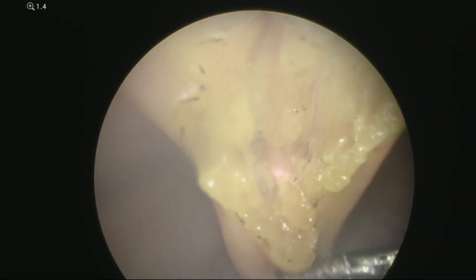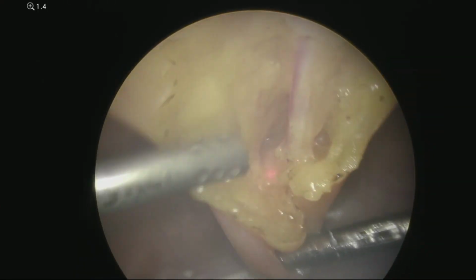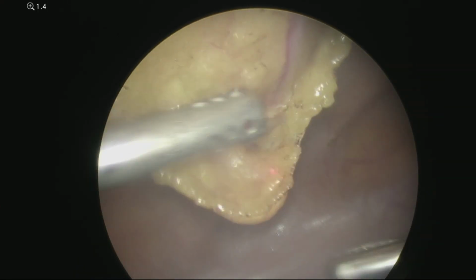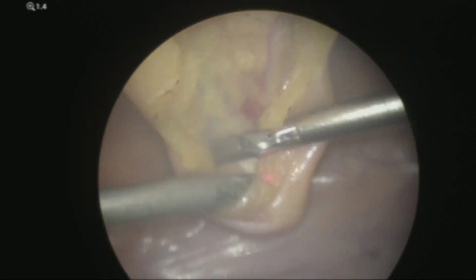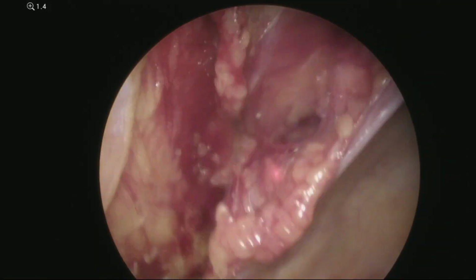In order to gain access to the mass, the space of Retzius was opened using the CO2 laser by incising between the medial umbilical ligaments. Dissection between the medial umbilical ligaments ensures avoidance of the inferior epigastric vessels.